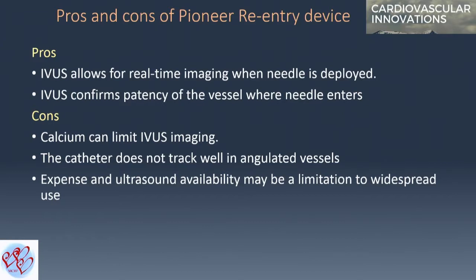Calcium can be a limit to IVUS, and the catheter usually does not track very well in our experience. I don't know about the newer one that was released, but that was from the previous Pioneer catheter that we had. Expense and ultrasound availability may be a limitation.